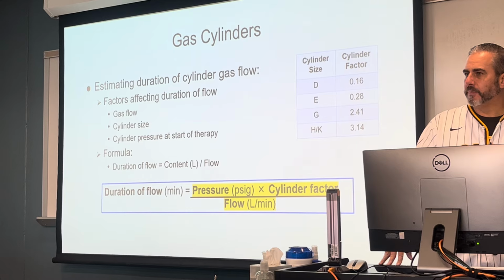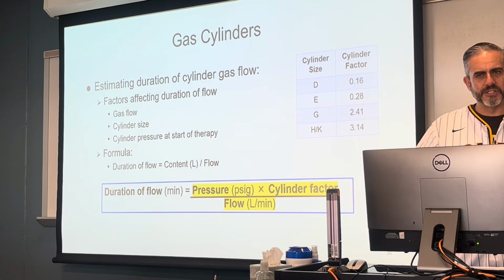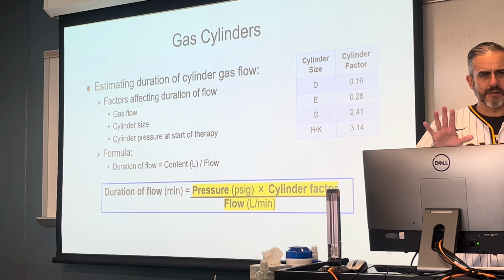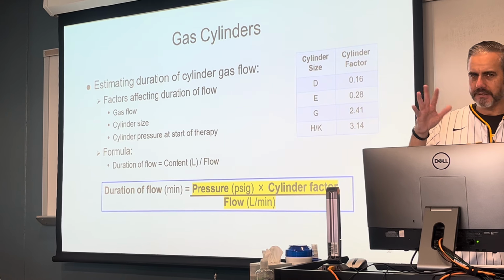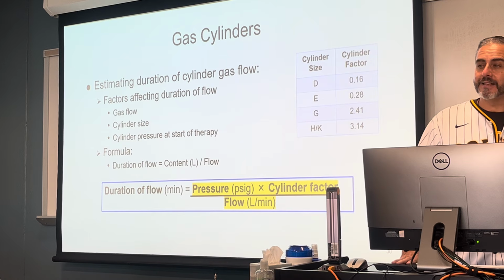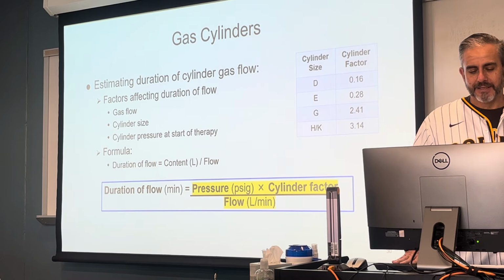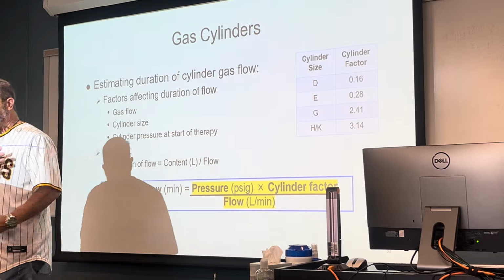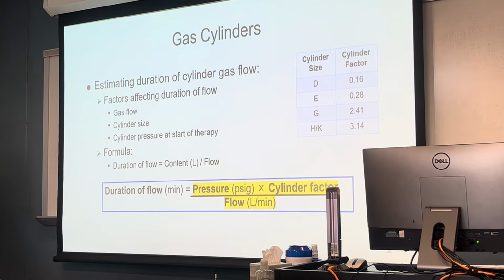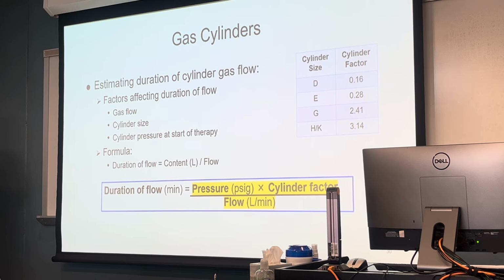Now, some of you that have spent some time with Desmond have probably gone over cylinder duration. Yes? Comfortable with it? Those that have had an opportunity to, guess what? Like anything else, there's a formula for that. So, to know how long this tank is going to last, that's what this calculation is. It doesn't rank in my top 3 favorite calculations, but it is an important calculation.